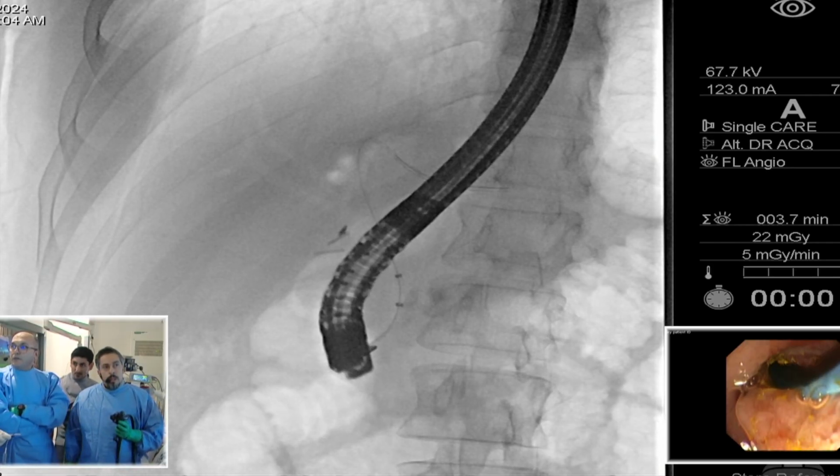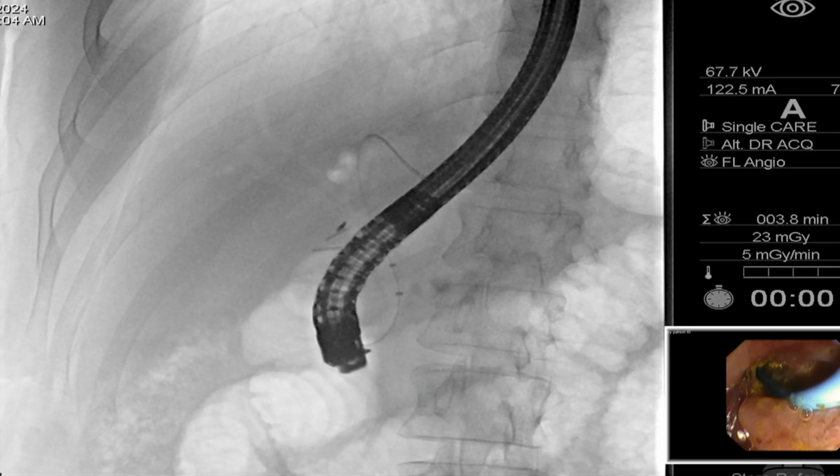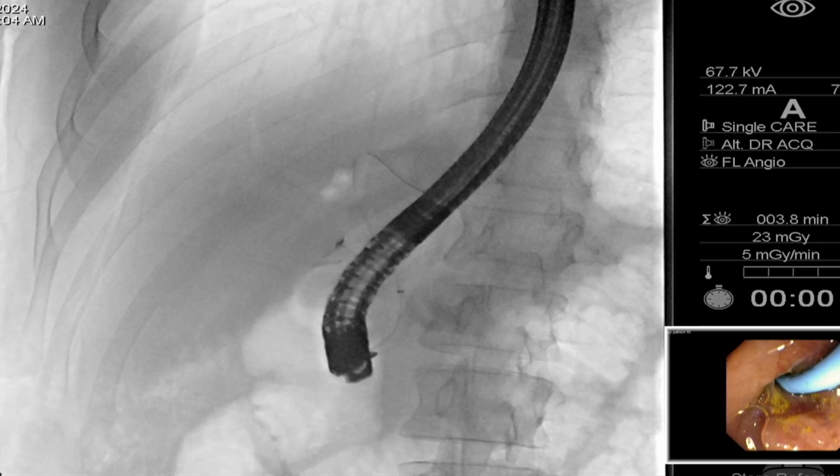So you agreed now there is no distal stricture? No. Actually, when we were offline, I was telling my colleague Khalid, I really don't like calling it stricture. I just call it tapered duct.